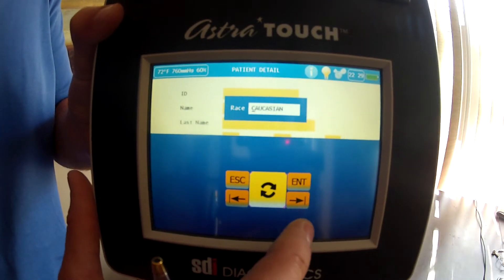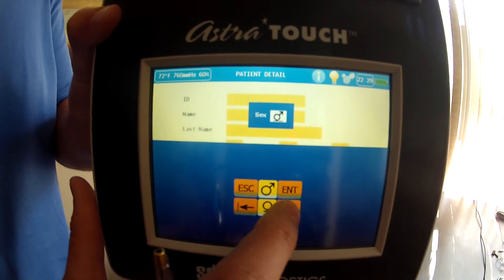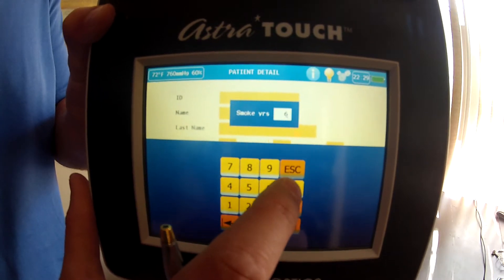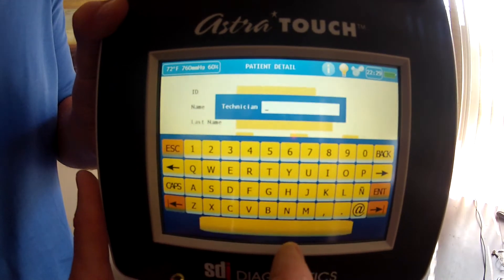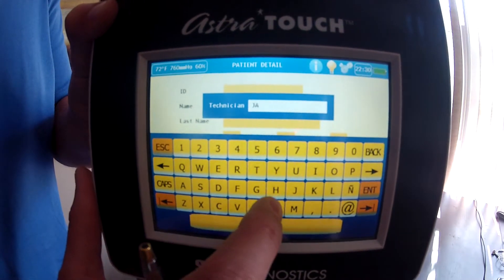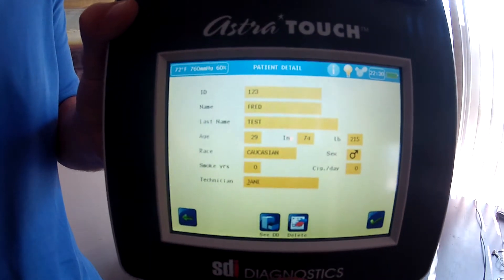Weight in pounds is 215. Ethnicity factor: Caucasian, male. Smoking years: zero. Cigarettes a day: zero. And then for the technician, I'm going to put 'Jane' and hit enter to finish it all up.